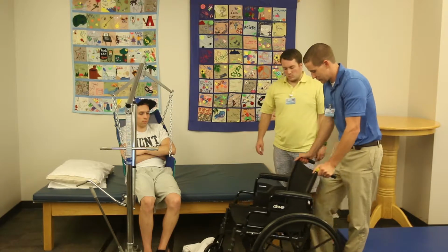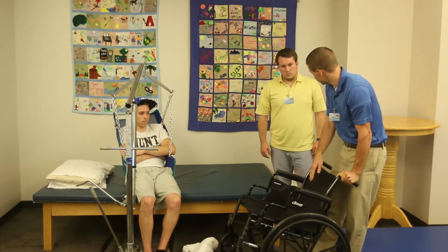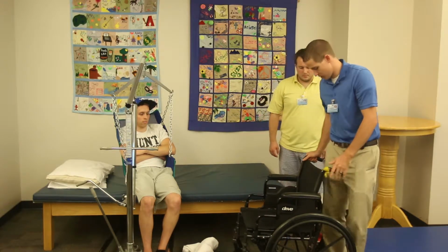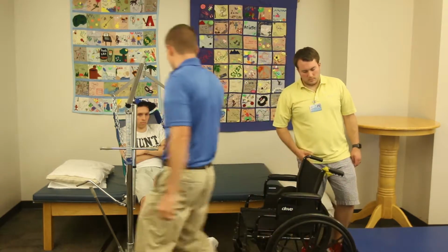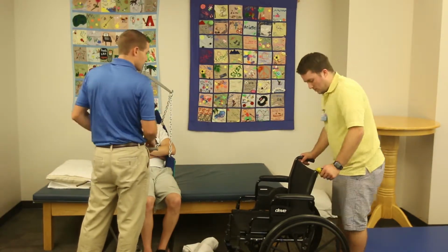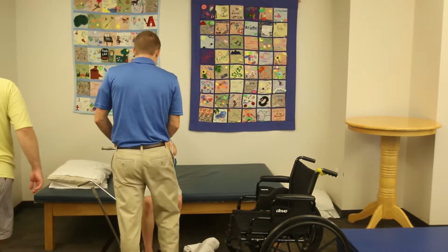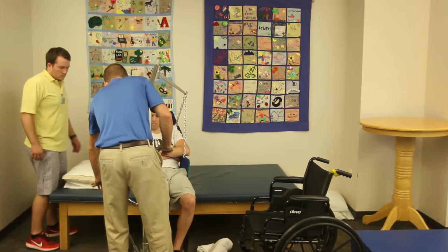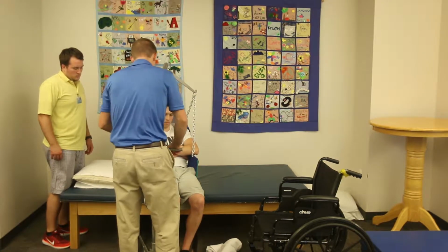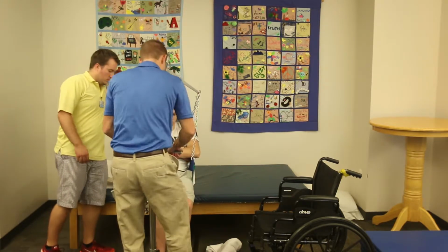Let me demonstrate for you real quick. So you're gonna be like this. One hand's gonna be on him, holding him back. As he's going down slowly, you're just gonna bring the wheelchair down with him. That sound good? Okay, so for safety first, as I bring him out, will you just come behind him just to make sure his neck stays supported? Still feeling okay, Jared? Okay. Give just a little bit more. All right. Keep those legs there and bring you out.